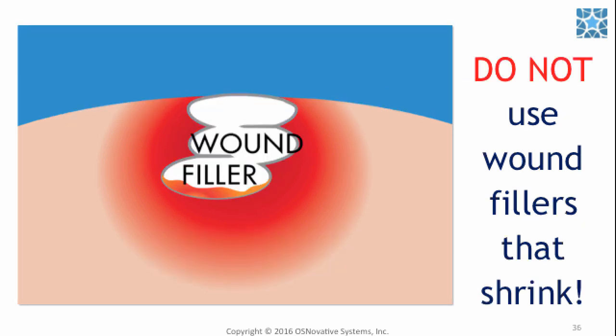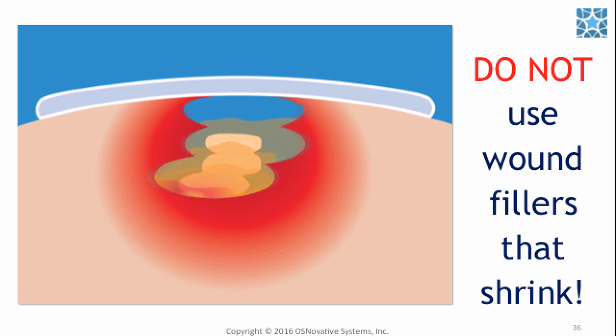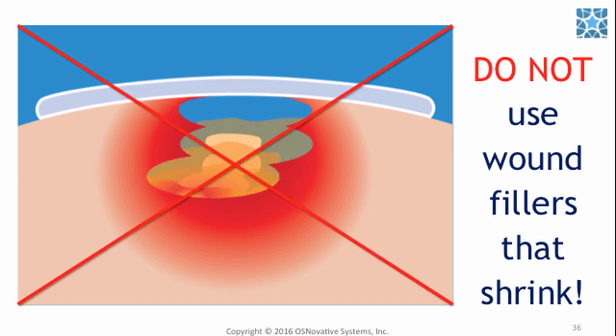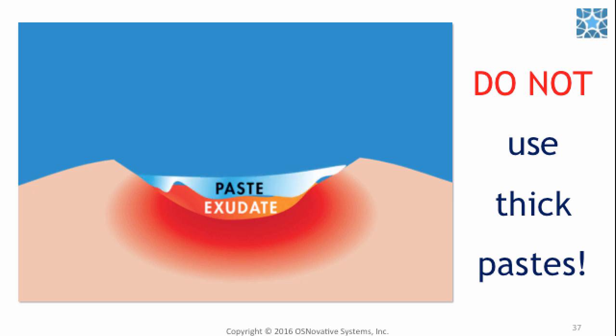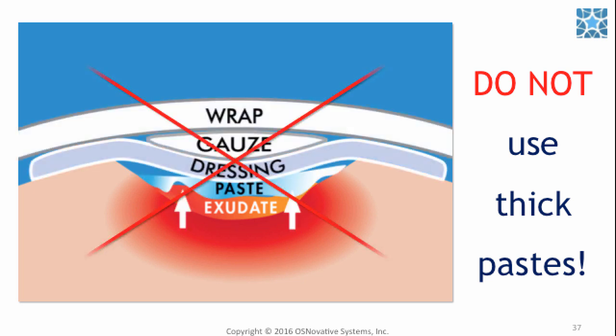Do not use fillers that shrink. Shrinkage will disrupt the transfer of exudate to the dressing surface, and the exudate will not be absorbed. Do not use thick pastes. They will block vertical draw, which in turn will cause wound maceration.